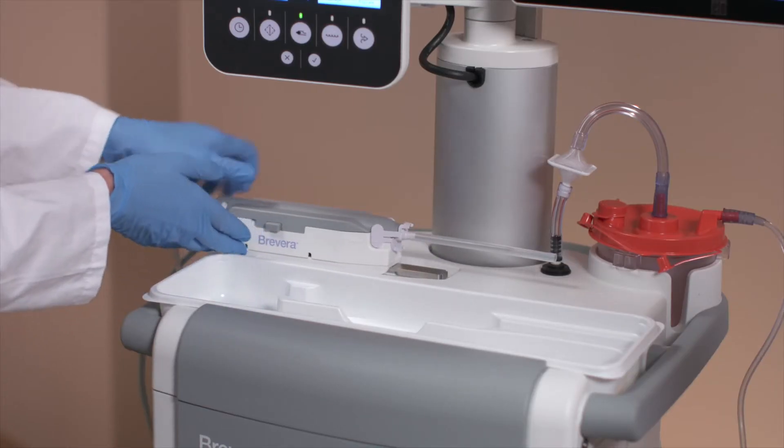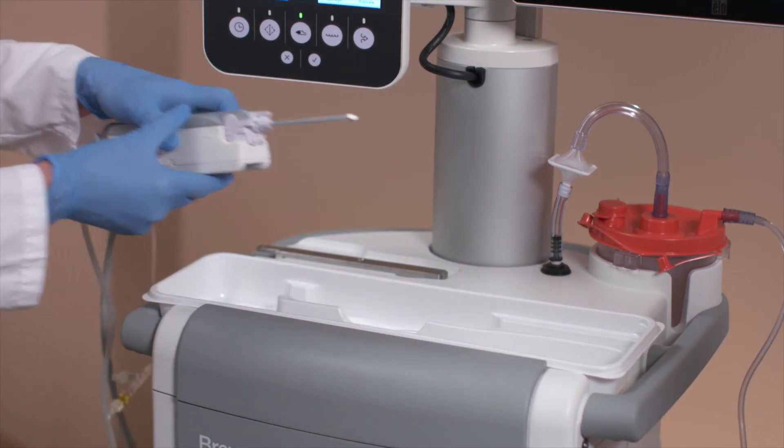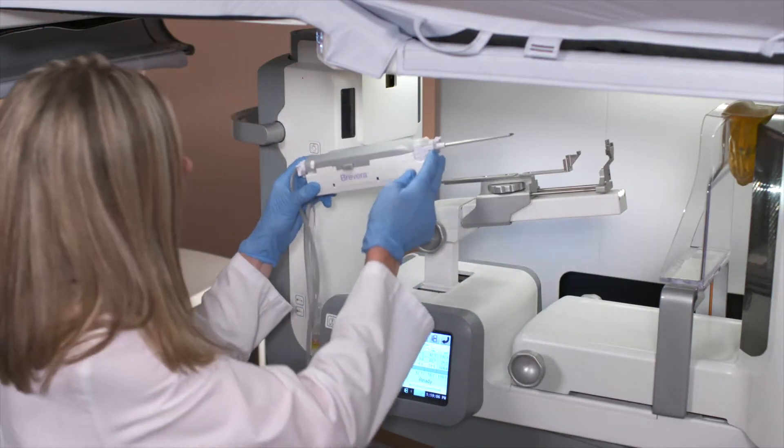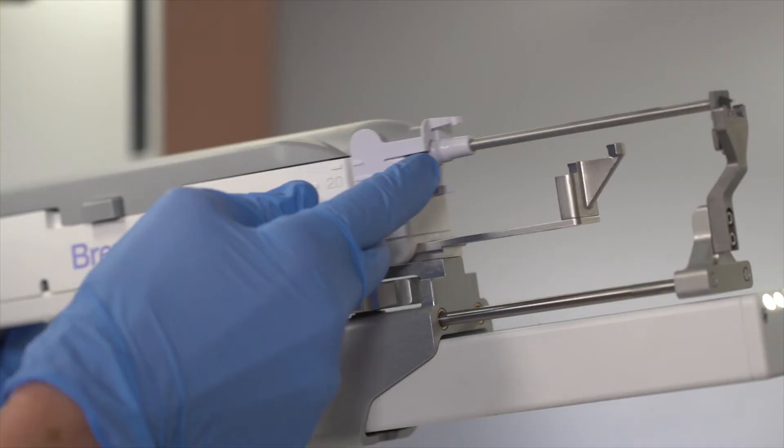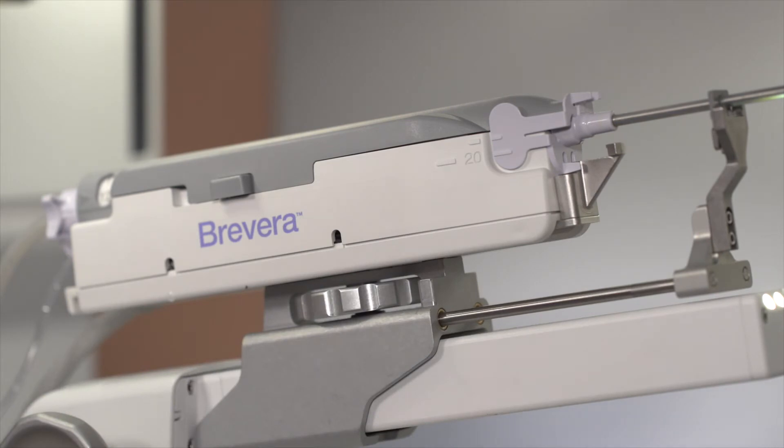Next, the technologist will remove the assembled device from the console and remove the protective sheath from the introducer. Then, they will slide the device onto the adapter on the imaging equipment until there is an audible click and the device is secure.